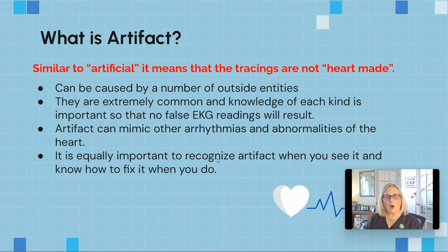So the term artifact just stands for like artificial. It means that the EKG strip, the readings, the little bumps, the PQRSTs are not coming from the heart. So that means they're not real. It's not a real heart monitor type reading. It can be caused by lots of different things. You just need to know where it's coming from, recognize what type it is, figure out where it's coming from, and then eliminate what's causing it. Okay.